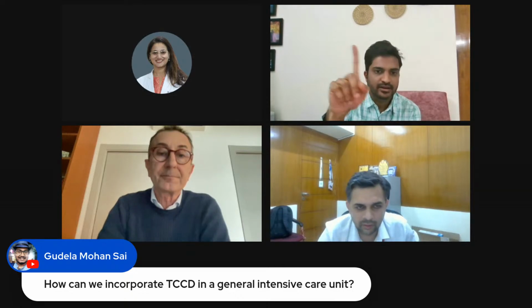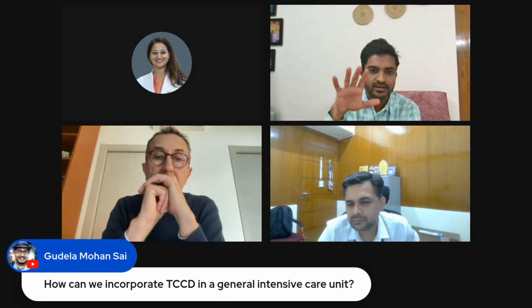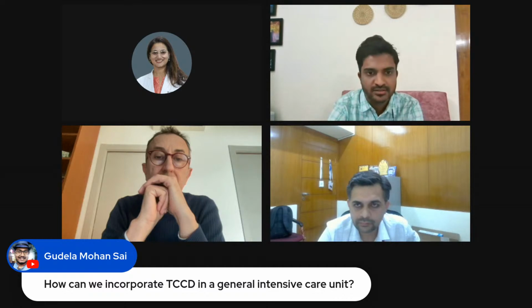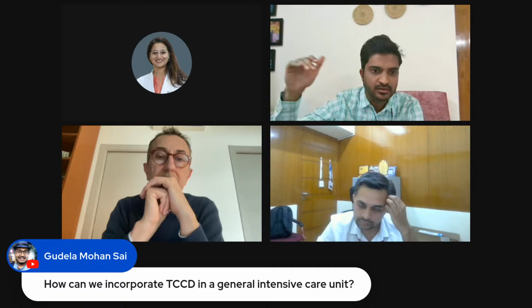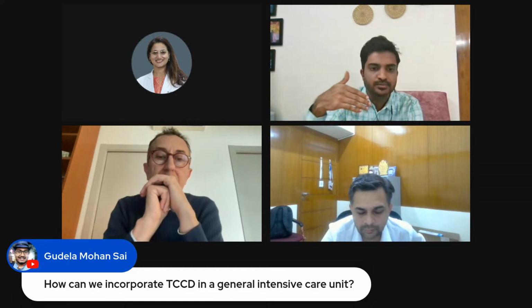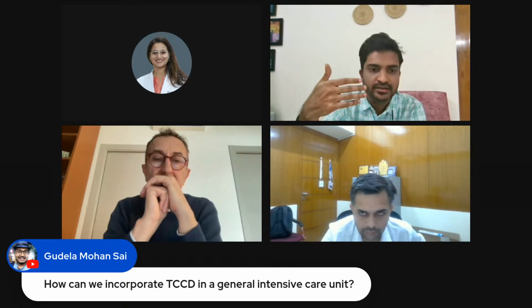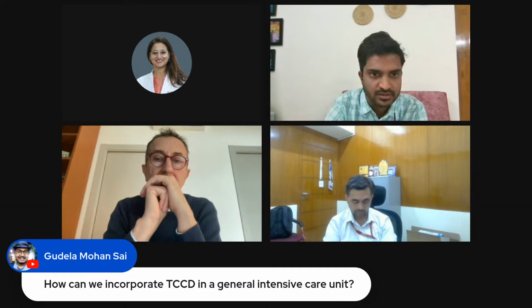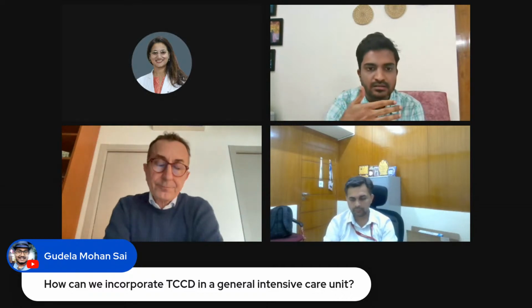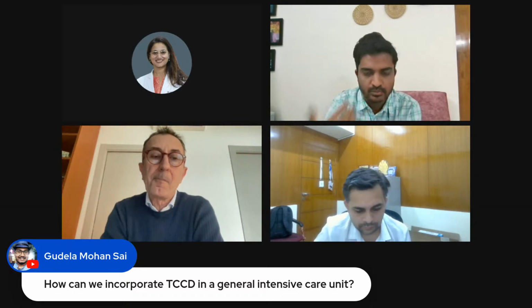Yeah, I would like to add. Yeah, go on ahead. Most of the transcranial Dopplers, TCD or TCCD, have been extensively researched in neurological and neurosurgical patients. So in other modalities, especially in the general ICU, it's more of a research-oriented topic, especially in preeclampsia or eclampsia or hepatitis, or even in post-cardiac scenarios or during CPR. There are studies where they try to incorporate looking at the TCCD velocities or patterns during the resuscitation to see how effective the resuscitations were during CPR. So this is an area of research probably people in the general intensive care unit would be more aware of.